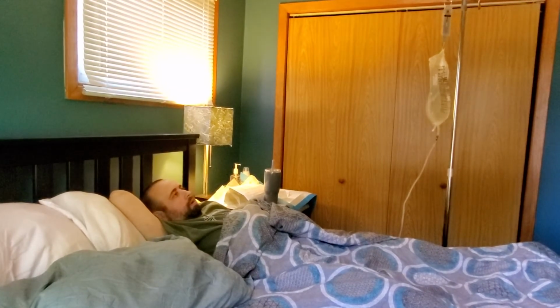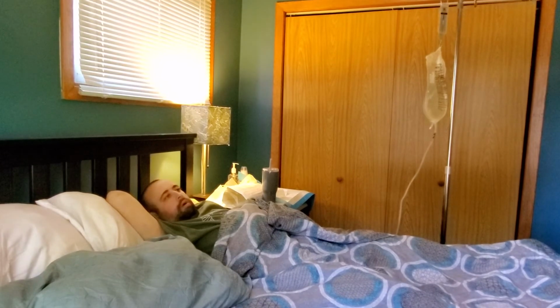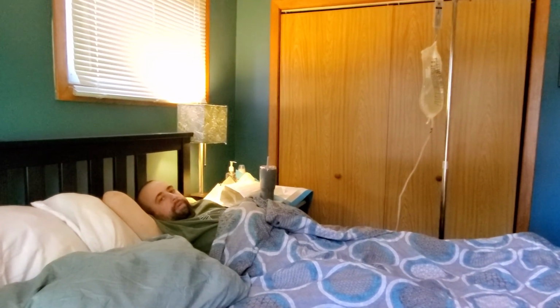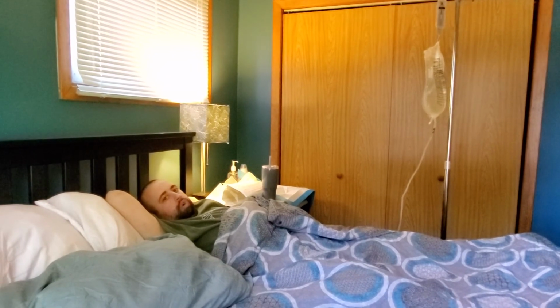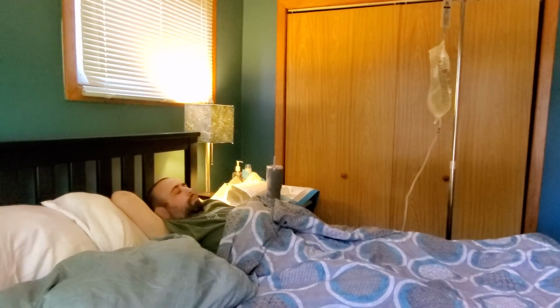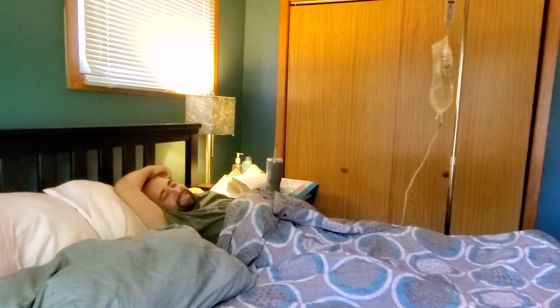I do that for, most people do about 4 cycles a day. Right now I'm only doing 2. When I switch to a cycler, it'll probably be 3 to 4 every night. However, we'll hook it up once and it'll just go overnight. Mm-hmm. In theory, you will be able to sleep through all of that, but yeah, we'll see.